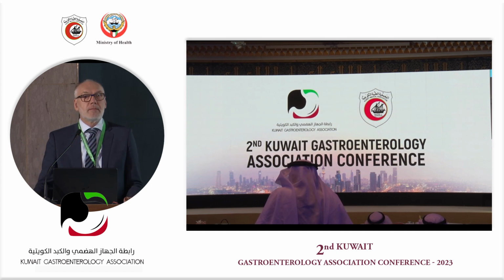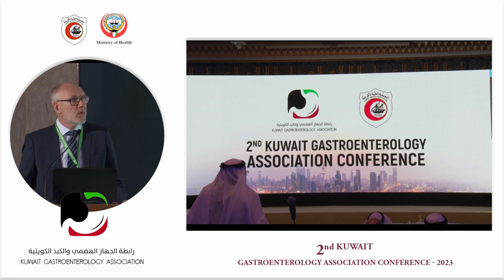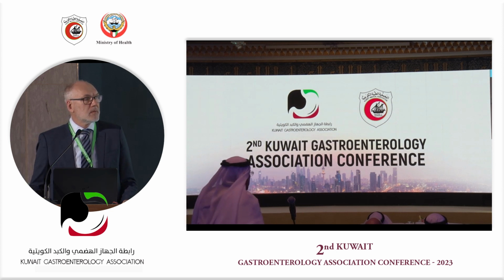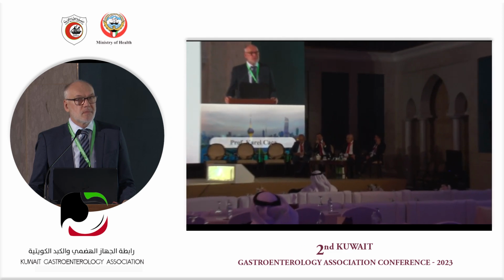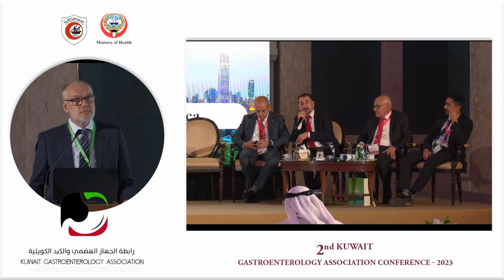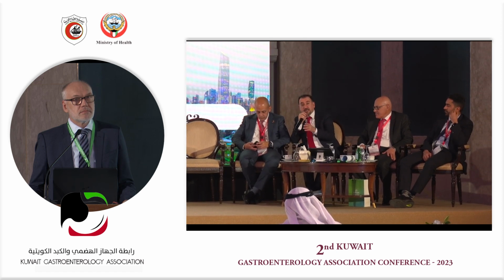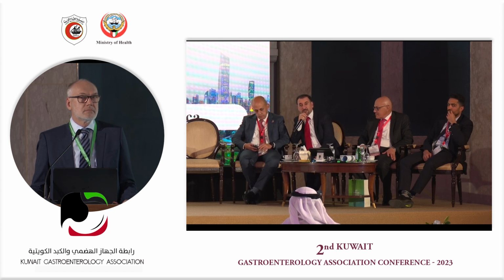Do you use pigtails? I think the data is clearly showing there is no benefit from Ovesco in an acute situation with leaks. So either internal drainage with a double pigtail, or you do a mega stent. It depends on the size. Is it a contained cavity or not? What's the pressure inside the stomach? Do you have an angulation or twist? These are all factors that will affect your decision about your next step.